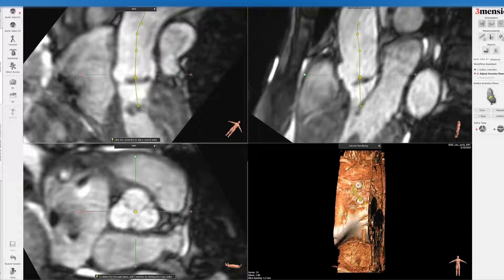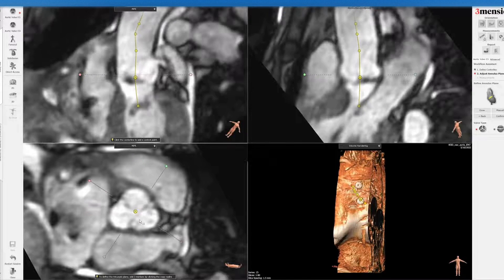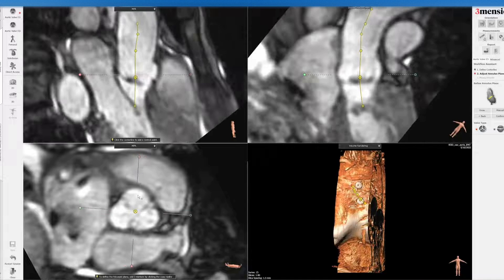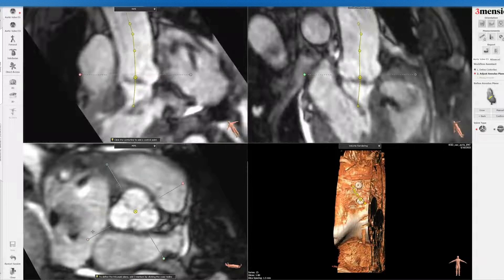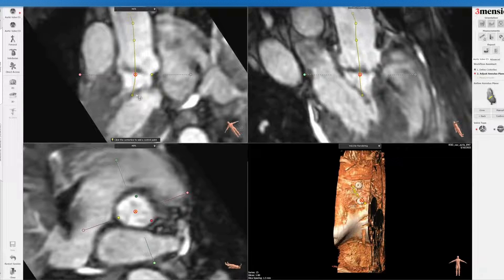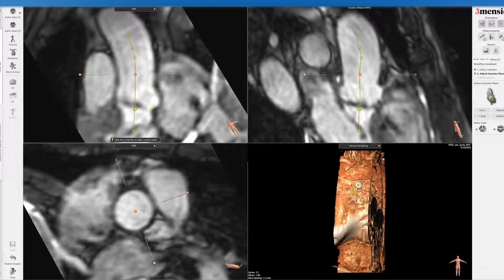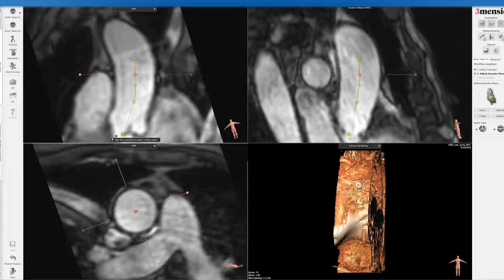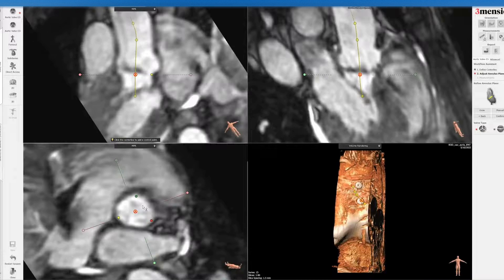First of all, you want to make sure this is a clean study with good resolution — you can see that it's pretty good. I do the same thing now with the open red circle, bisecting the left sinus, and put a dot on the left upper panel as the base. Then I rotate counterclockwise, bisect the right sinus, put it at the right base, and then do the same thing for the non-coronary cusp. So here you have a rough idea of what the annulus is, and of course you would verify these are all in the centerline estimation.